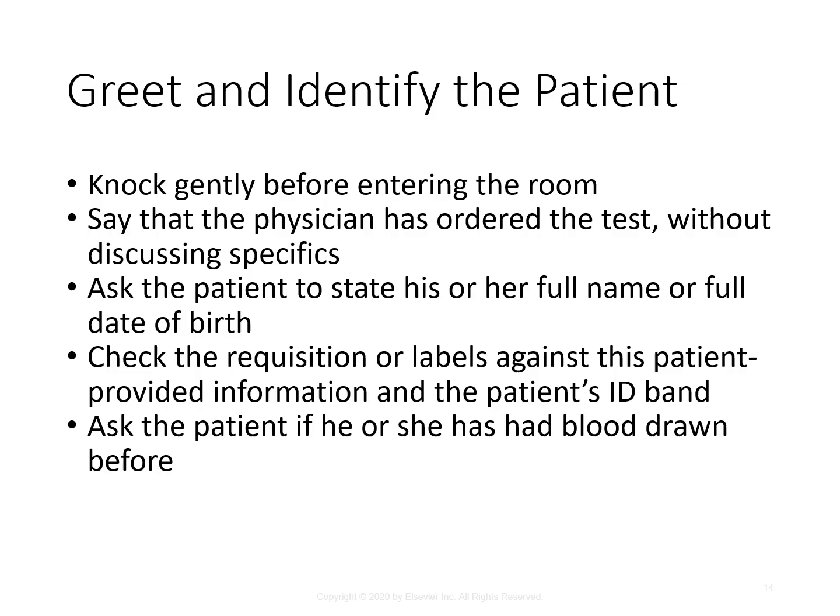So, going back to without discussing specifics of the testing. What that's referring to is we can tell them what we're drawing, if it's a CBC or a CMP or something like that, but we're not going to tell them why it's being drawn. That is not our place to try to interpret why the physician ordered these tests for the patient. You would say, I know we're doing a CBC, CMP, but you would need to check with your nurse or your doctor to understand why it's being ordered. Once again, it is not our place as a phlebotomist to be trying to interpret why they are ordering what they're ordering.